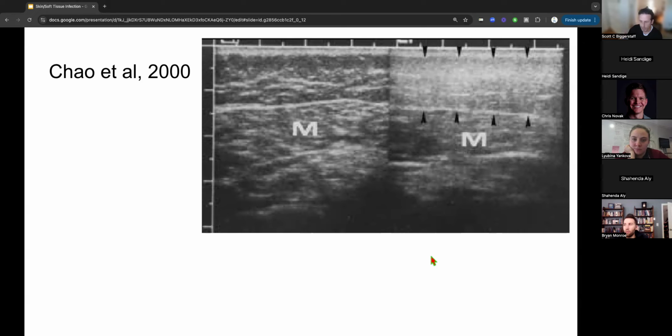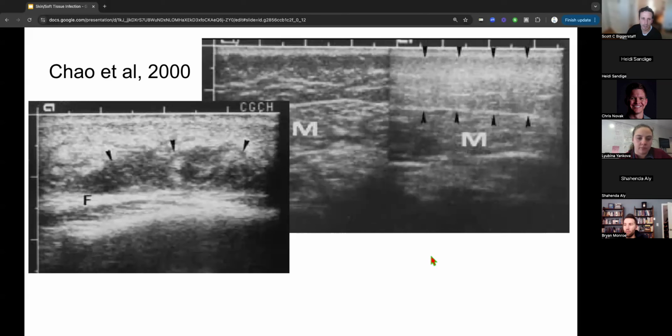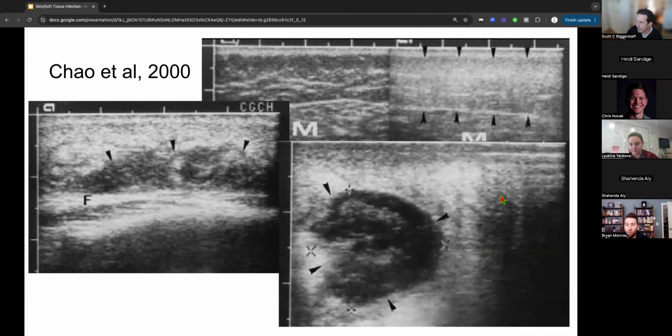So the only thing really that maybe adds to our discussion is, if the kid has had that infection for more than a couple days, it's probably worth looking at just to see if there's anything more organized or collected there. And then most with abscesses had symptoms for at least 4 days. And just some images from their paper.